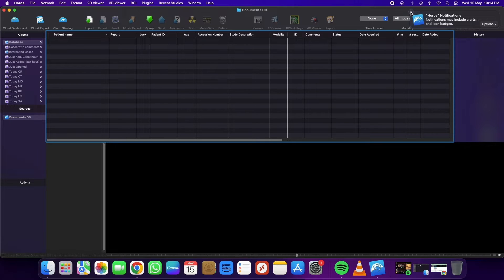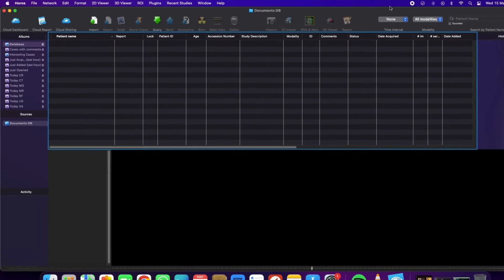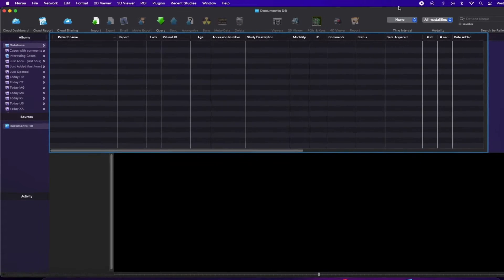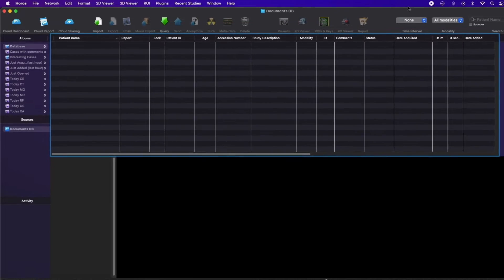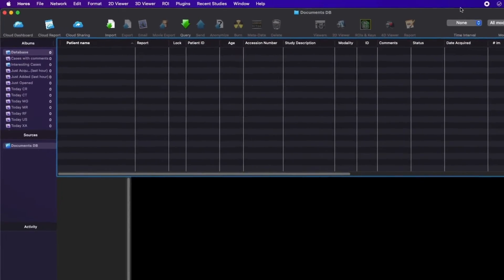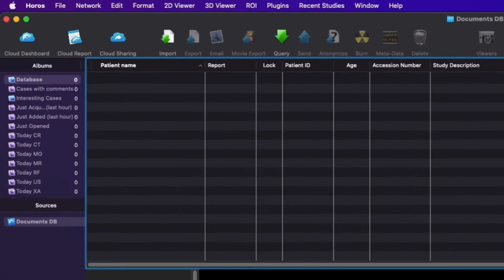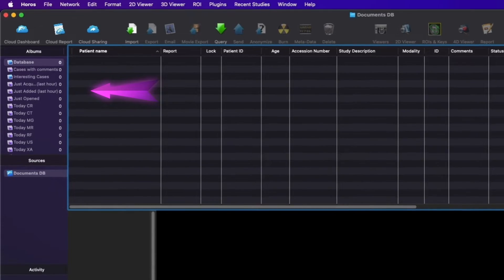The UI is very simple. On the top menu, you will find various tools like import and export, query and send, 2D and 3D viewer, and more.